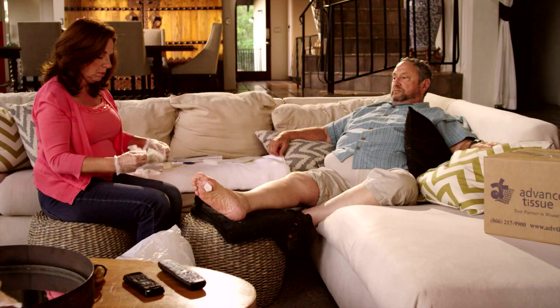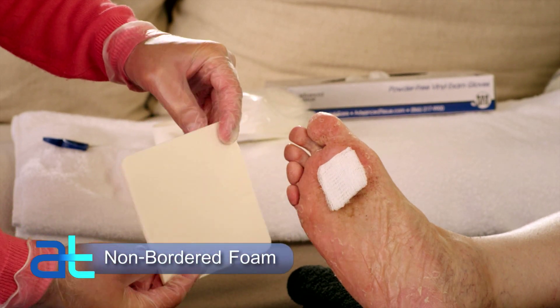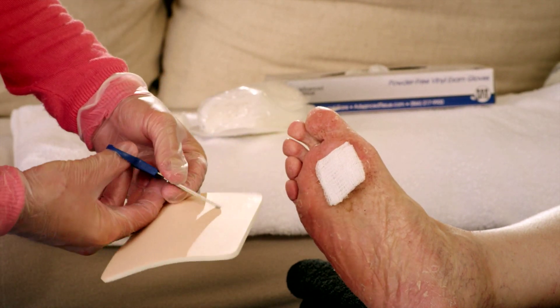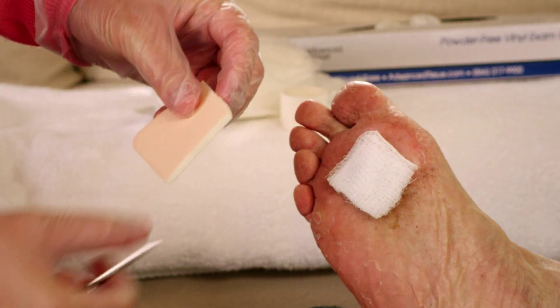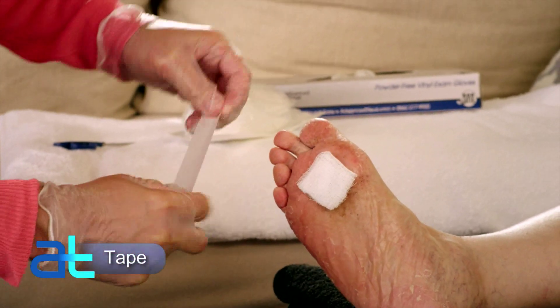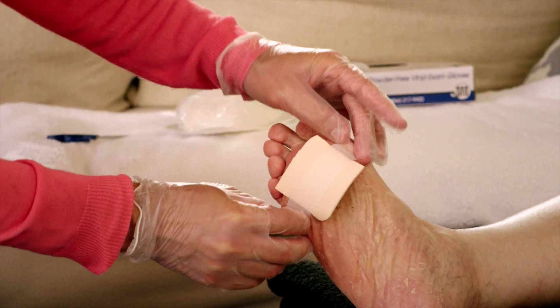That's perfect. Now apply the foam dressing. Some patients find it hard to identify which side of the foam sheet should be placed toward the skin. Generally, the dull side goes toward the wound. However, there are some brands where the shiny side is tacky — in that case, the tacky side goes toward the wound. The foam should extend one to two inches from the edge of the wound. This dressing requires that the borders be taped to hold it in place. Only use tape safe to apply to the skin and secure it well on all sides.